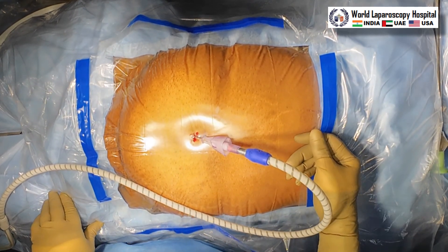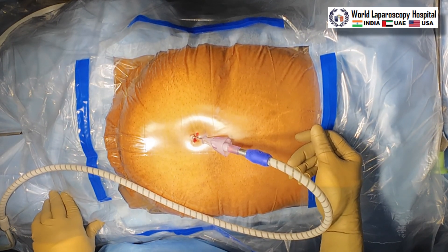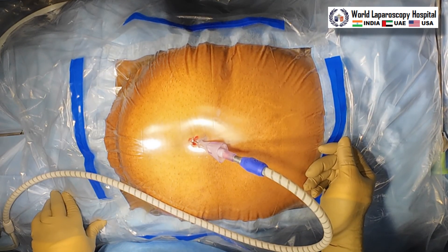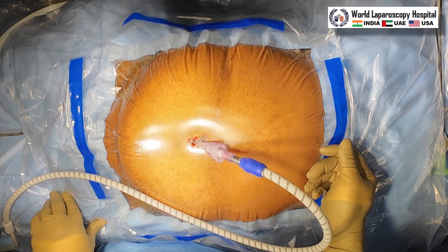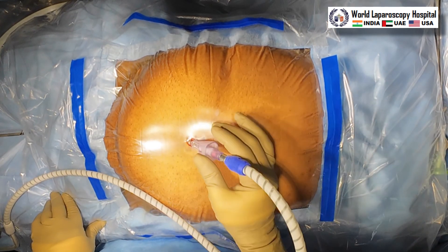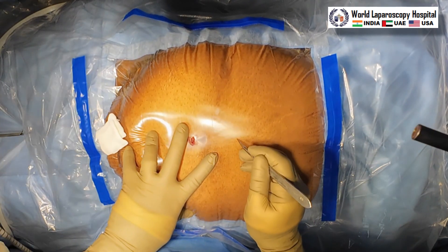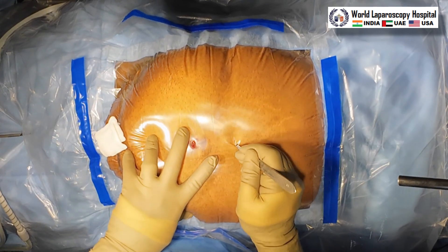Just a one millimeter stab wound is given over the inferior crease of the umbilicus, and we are waiting for the flow to stop. As soon as the actual pressure reaches the set pressure, the flow will automatically stop. After that you can remove the Veress needle. We can see the stretch of the abdomen is very nicely visible, and now we will give the supraumbilical port approximately 5 centimeters above the umbilicus.